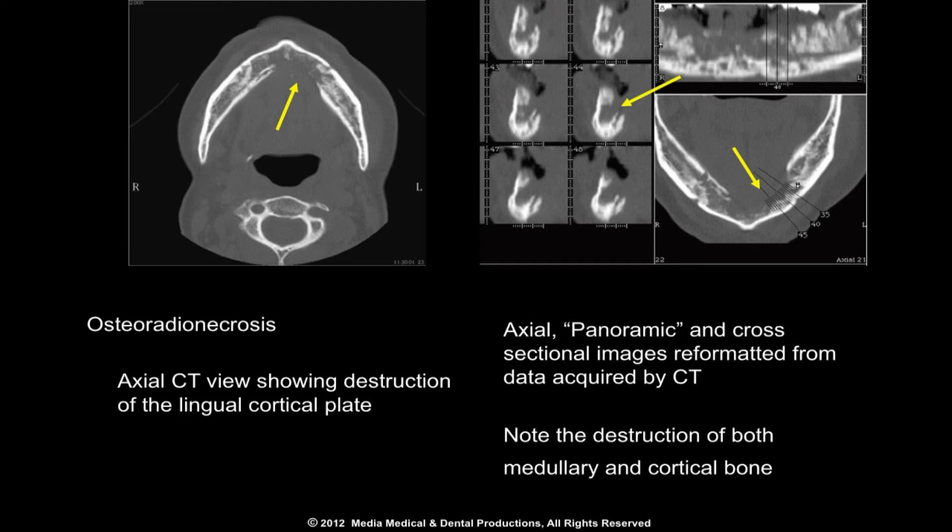Radiographs show an ill-defined mixed radiolucent-radiopaque lesion to an almost completely radiolucent lesion involving a significant area of the jaw. In these images of the previous patient, note the destruction of both medullary and cortical bone. A diagnosis of osteoradionecrosis is not difficult when the patient reports a history of radiation therapy directed to the head and neck region.